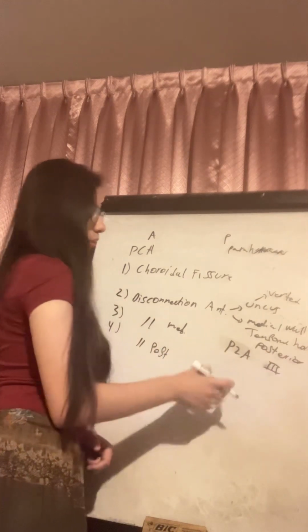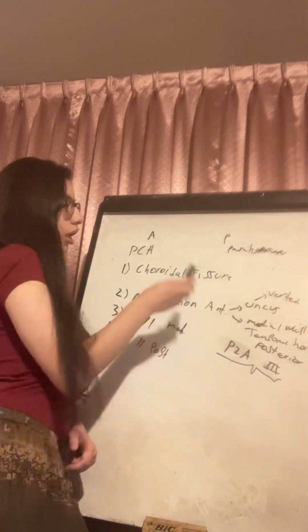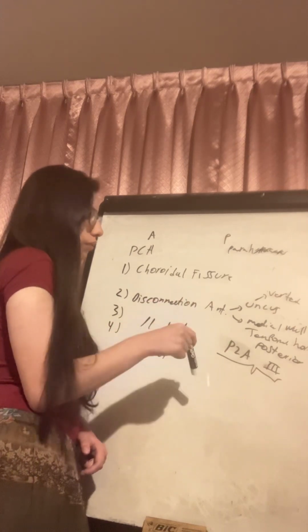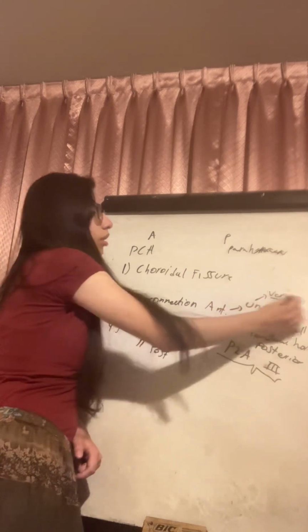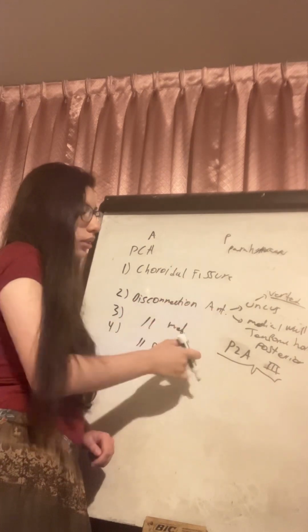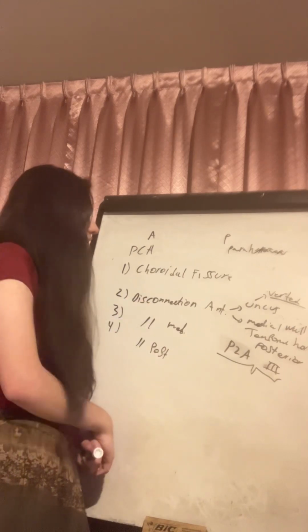This is very important because when we can visualize these structures, it means that the inferior portion of the posterior medial surface of the posterior segment and the inferior portion of the vertex have been removed. Both the superior portions of the uncal parts continue to be not removed.